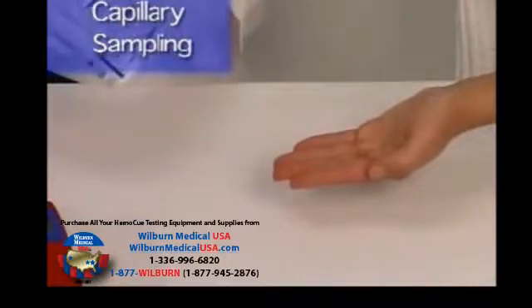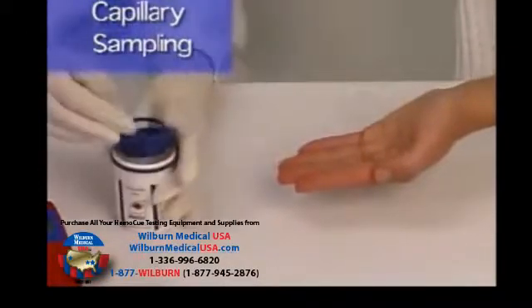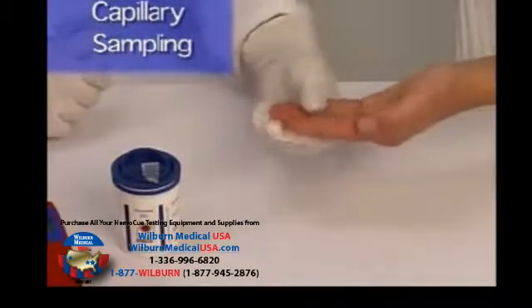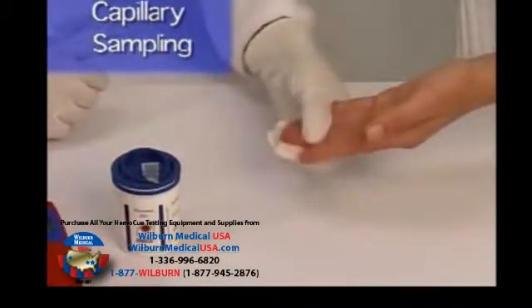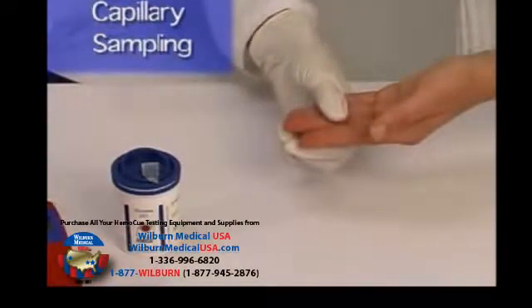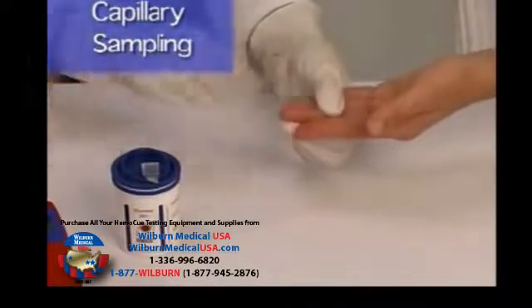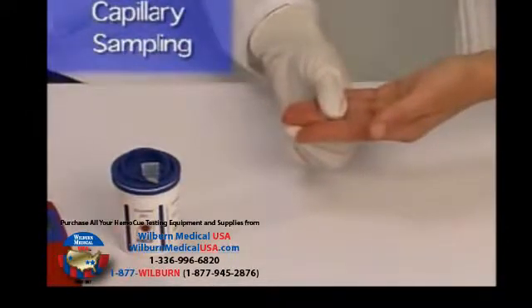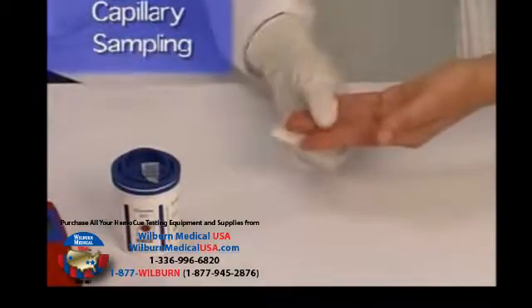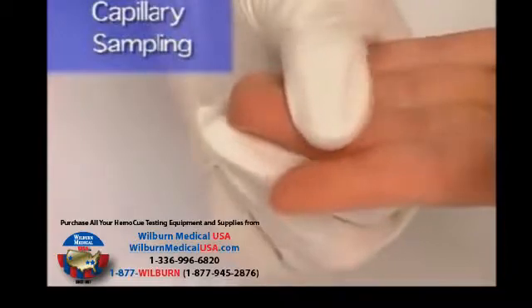Next, take a microcuvette out of the vial and close the vial immediately. Make sure that the patient is seated comfortably. The hand should be warm and relaxed. The patient's hand should be straight but not tense to avoid stasis. For best results, use the middle finger or ring finger for sampling and avoid fingers with rings. Clean the intended puncture site with a disinfectant and allow it to completely dry, or wipe off with a dry, lint-free wipe.